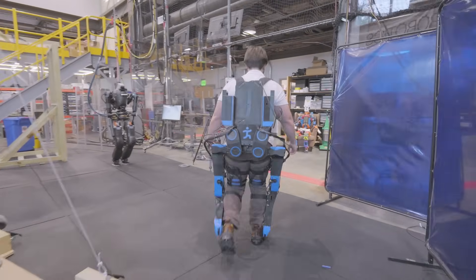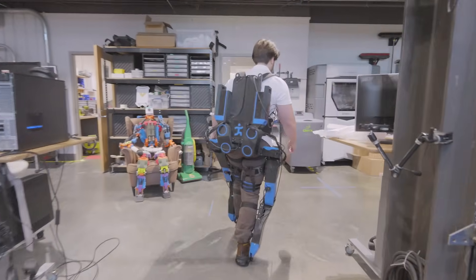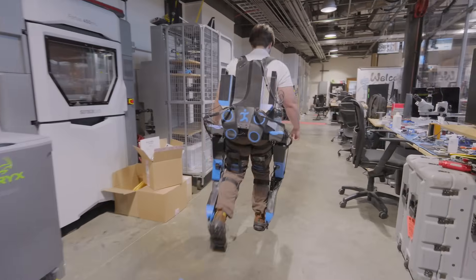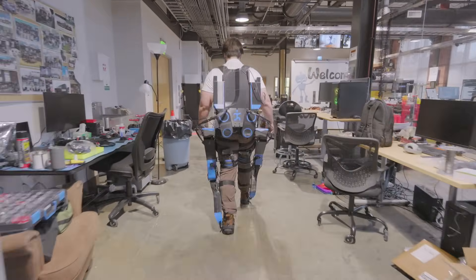One of the cool parts about AVA is that because the hips have all three degrees of freedom unlocked, and two of them powered, it's able to provide a lot of assistive force as I'm moving, but also to allow me to move naturally. It allows me to pivot on a much smaller radius.